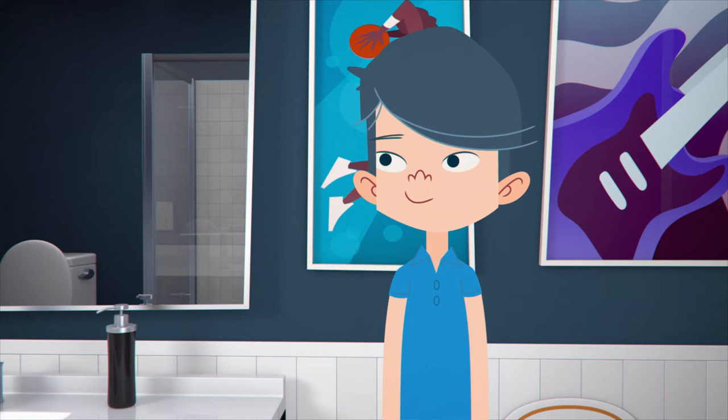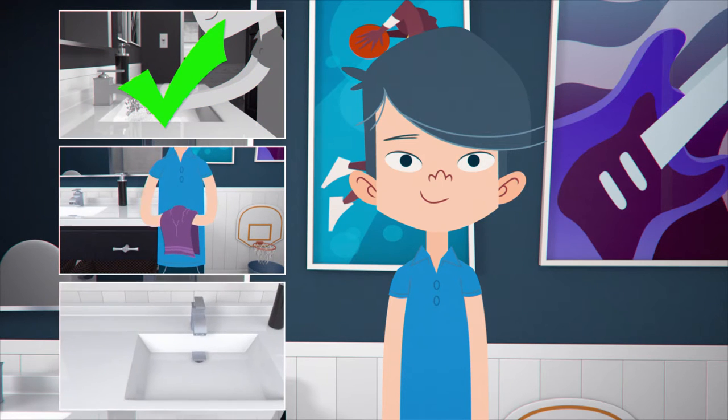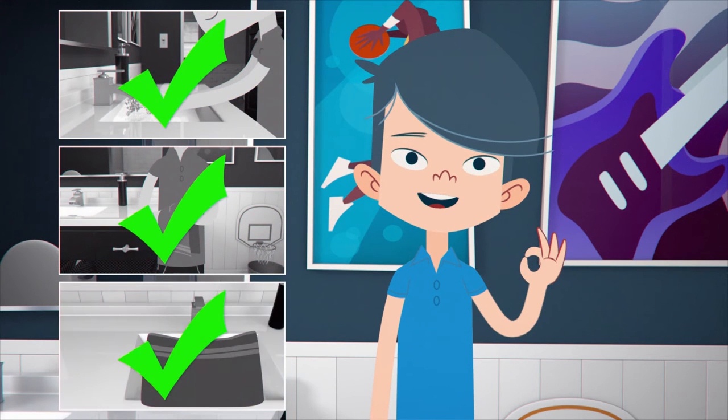First, begin by thoroughly washing and drying your hands. Then place your towel over the sink to keep your lens from going down the drain if you drop it.